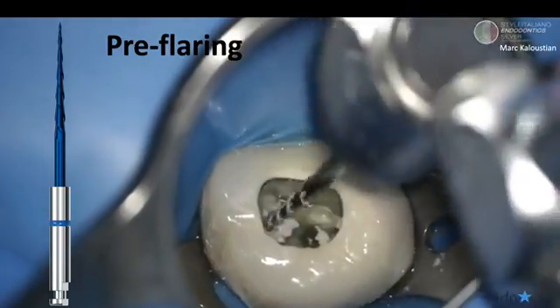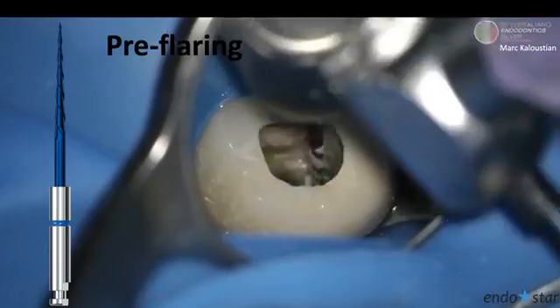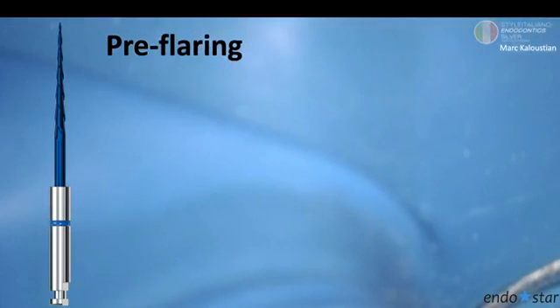So I am doing this number 7 pre-flaring in all the canals, the mesial one, then the distal one, the mesial one, then the palatal one. And you can see here how much debris we have on the file when we are using this instrument inside the canal. I'm very happy when I see this, because this means that my instrument is very efficient.